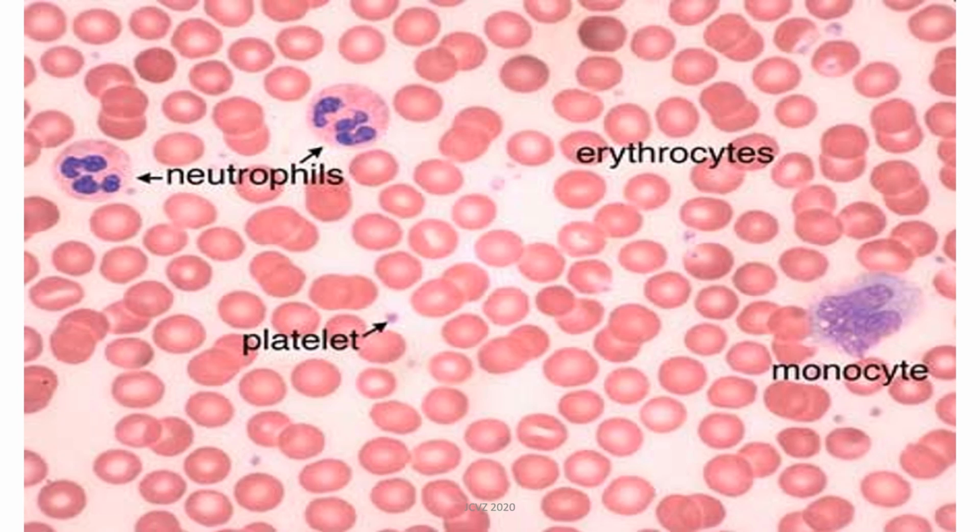So look at these cells. Although some of the red blood cells here are overlapping, there are still spaces between them that you can distinguish one from each other. So this is how the monolayer area of your peripheral blood film would look like under the microscope.